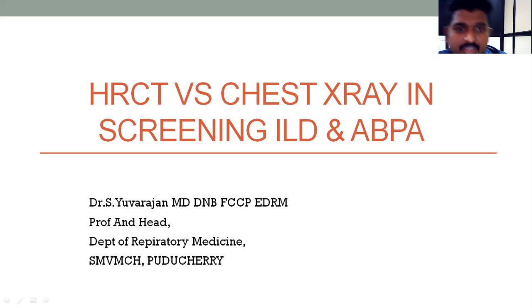So, without wasting much time, as the time allotted to this topic is very less because ILD is a huge ocean. Radiology is very important in diagnosis and also in managing all the ILD subsets. So let's begin with this talk on HRCT versus chest X-ray in the screening of ILD and ABPA.